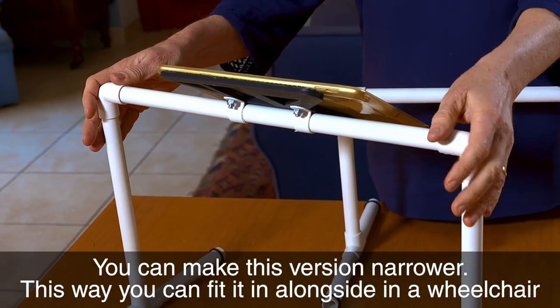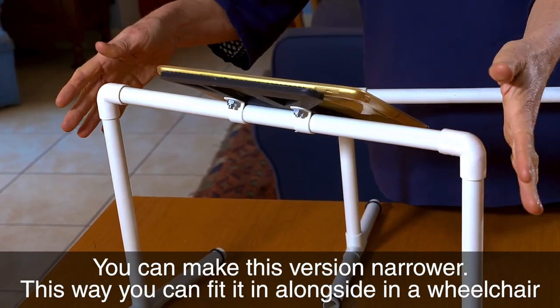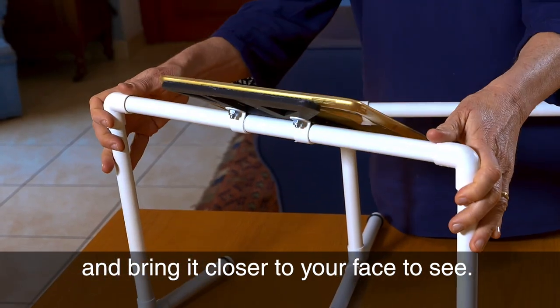You can make it narrower so you can fit it alongside in a wheelchair and bring it closer to your face to see.